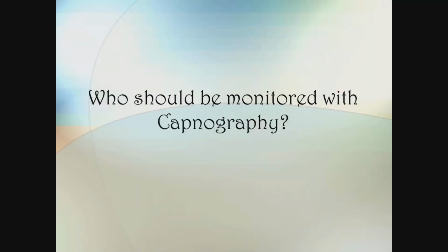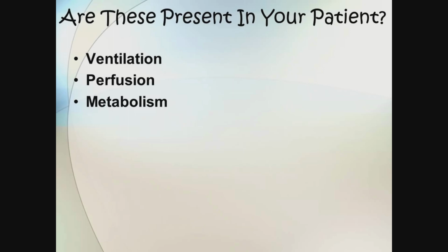Amanda. Who should be monitored with capnography? If these are present in your patient, you should be monitoring with capnography. The European Society of Critical Care Medicine made a recommendation that any patient who's being mechanically ventilated in the ICU should be monitored with end-tidal CO2.